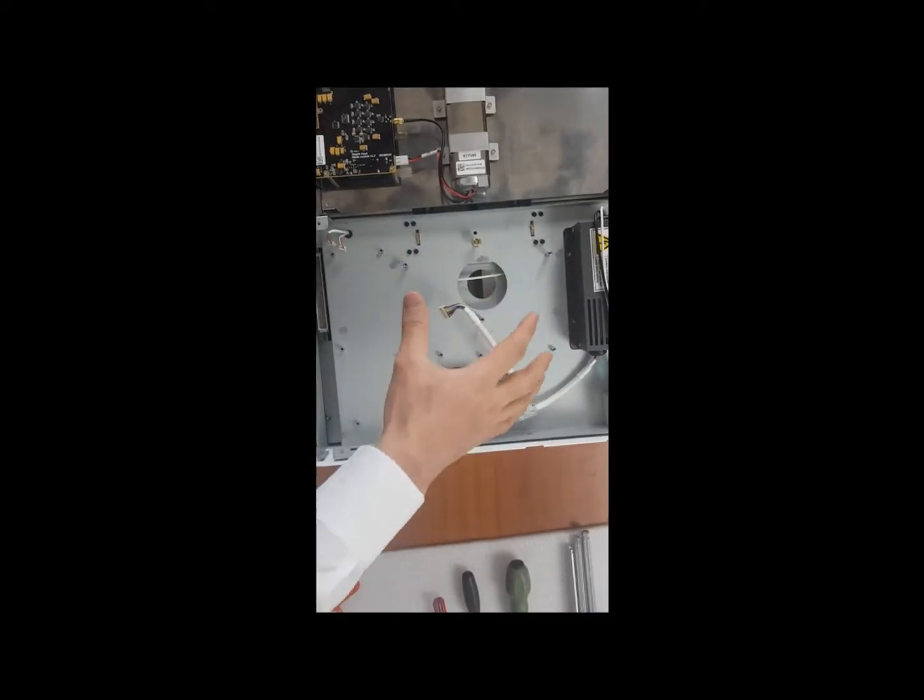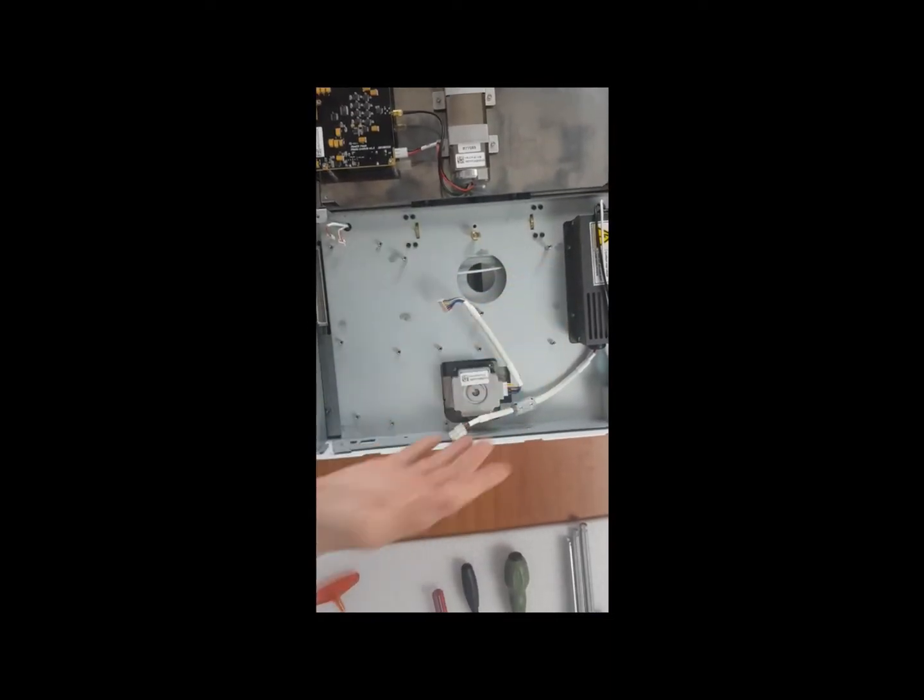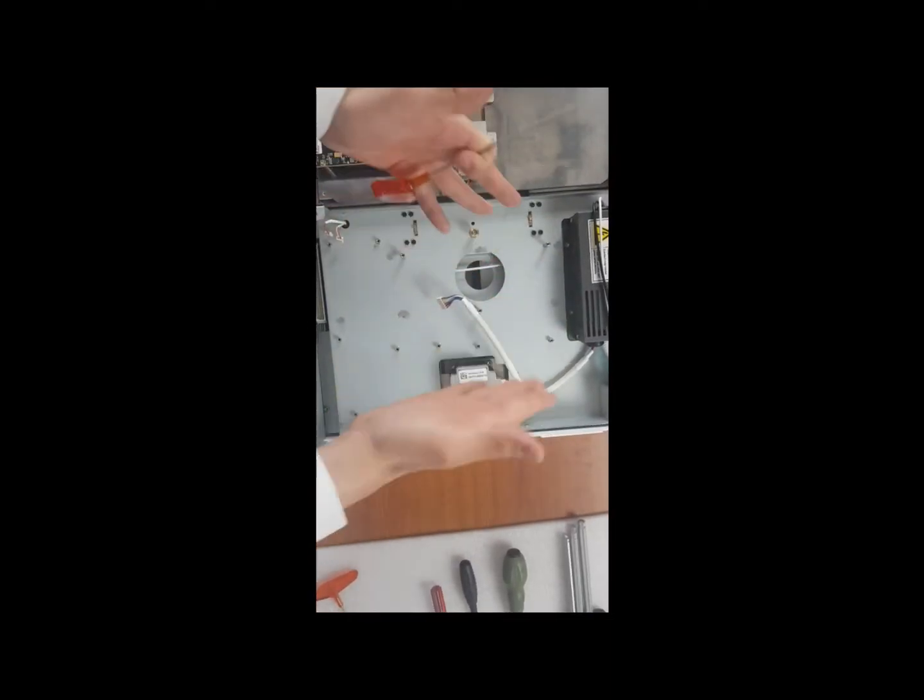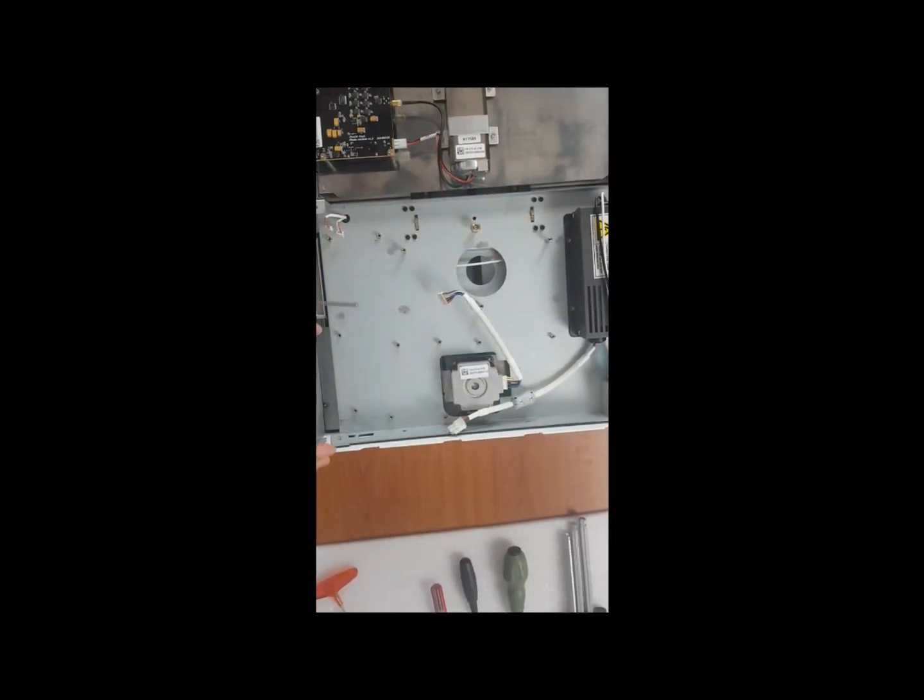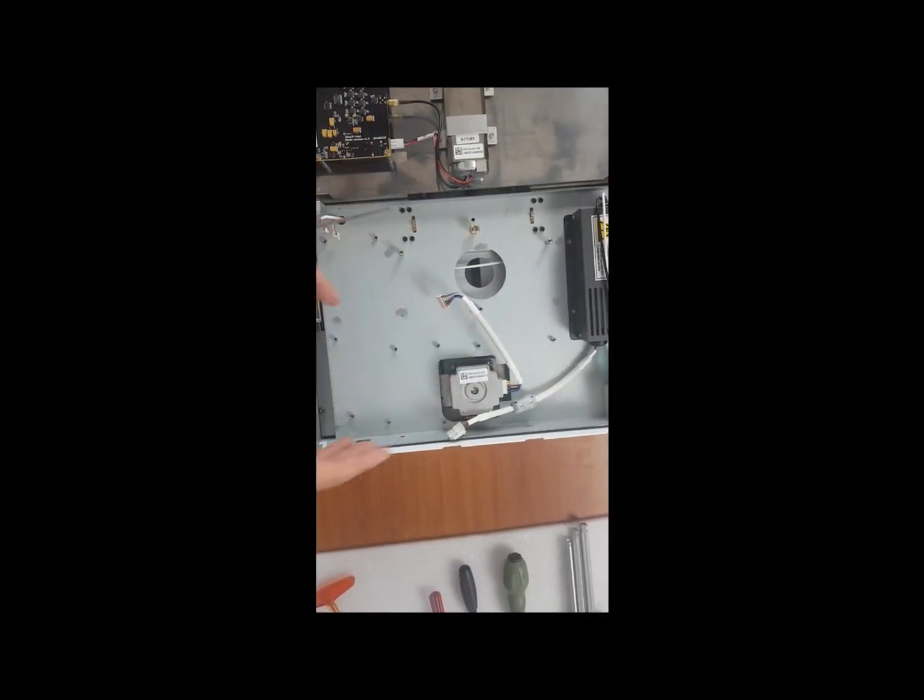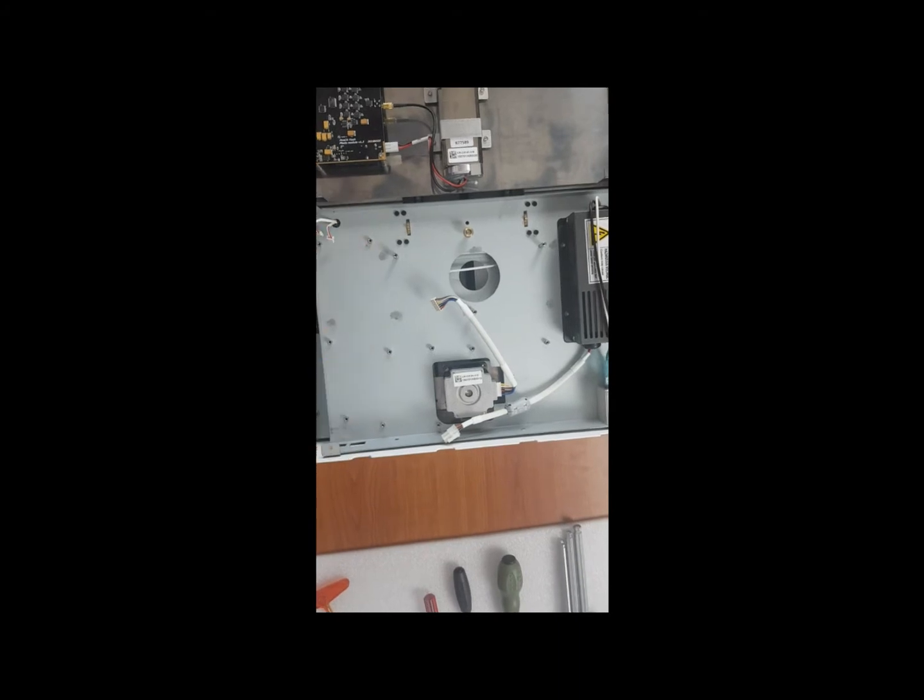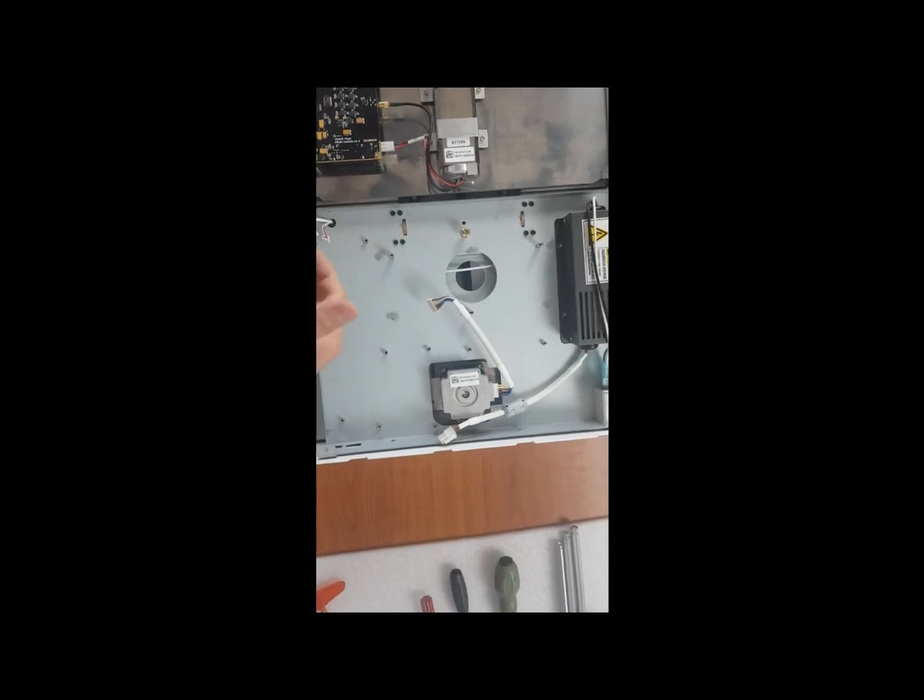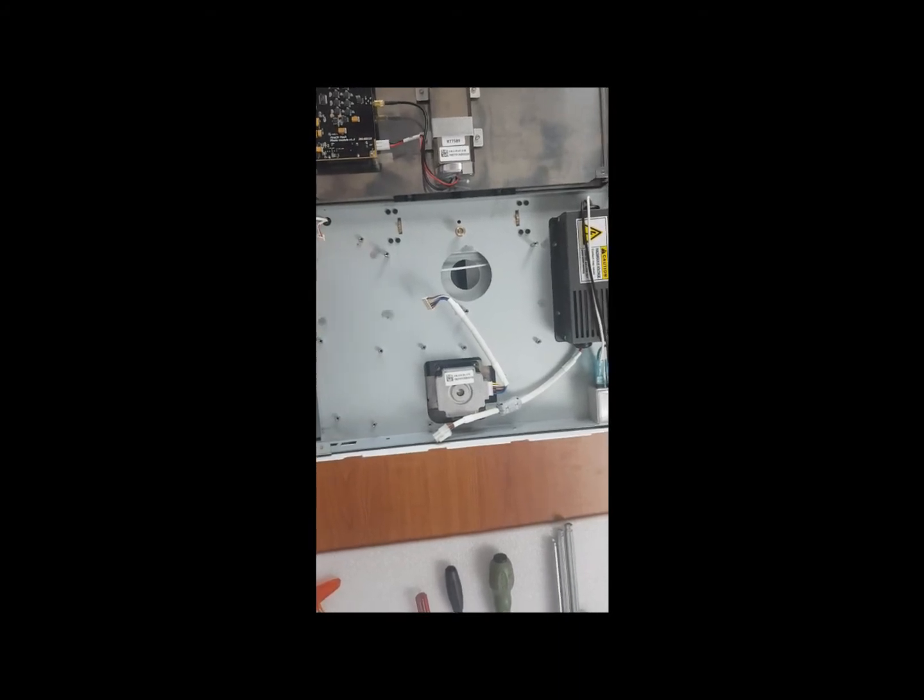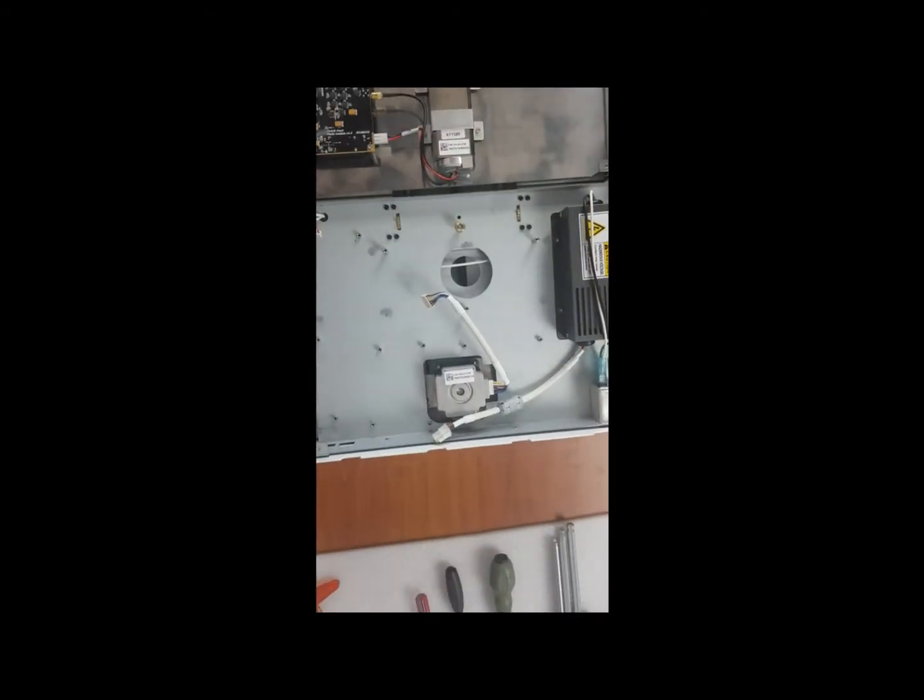So as I said, given that the octiplate and mainboard have been removed from the scanner, it's time to remove this board here.